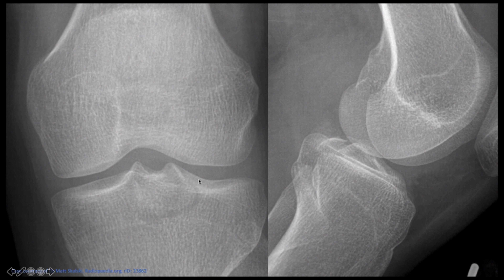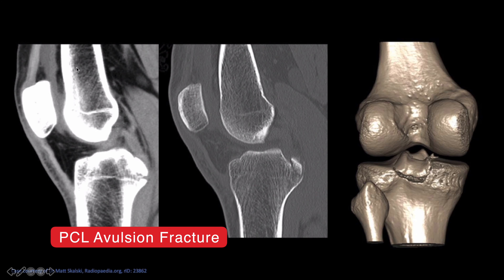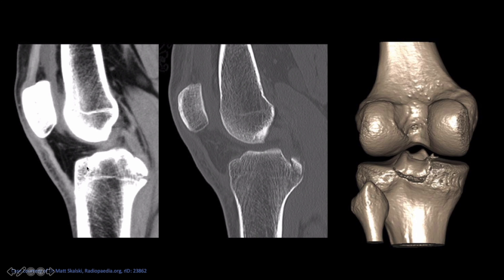Another case of an avulsed bony fragment - you can see a slightly displaced fracture with a loose fragment here, typical for a PCL posterior cruciate ligament avulsion fracture. You can see it on the CT here in the soft tissue window in the sagittal plane - that's the PCL, and this is the avulsed segment, also visible on 3D reconstruction looking at the knee from the back.